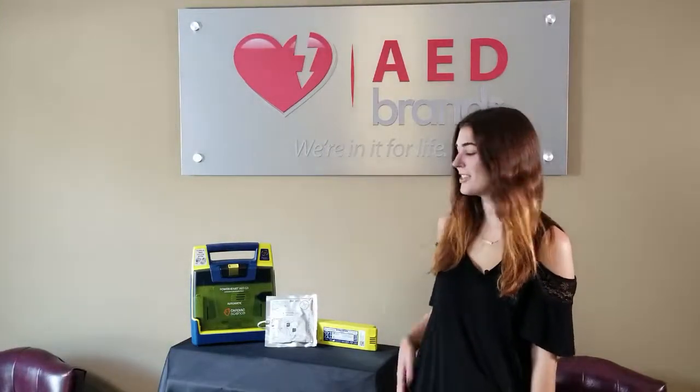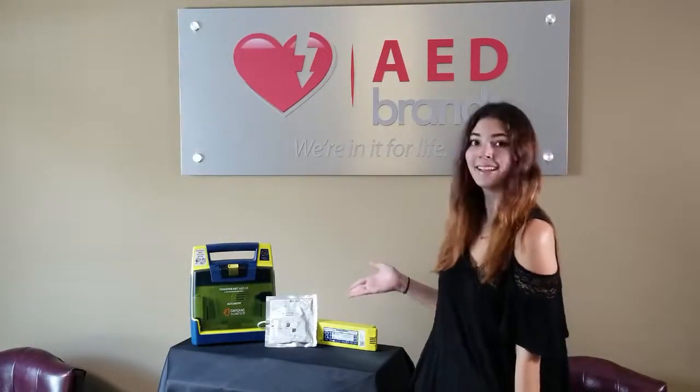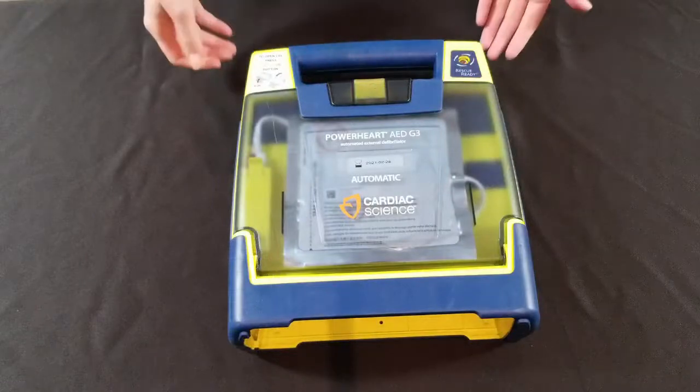Hi, this is Diana with AED Brands, and today I'm going to show you how to replace your Cardiac Science G3 pads and battery. Let's see how it's done. Start by replacing the pads.